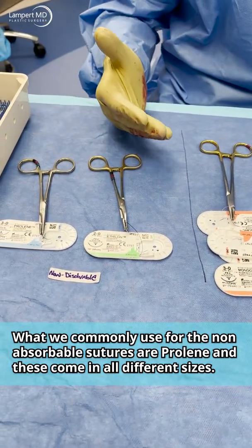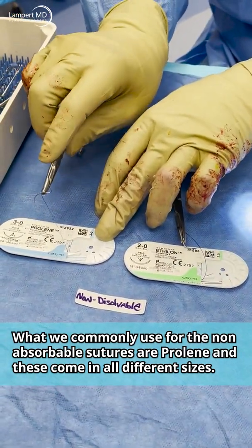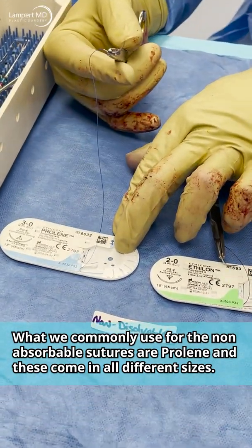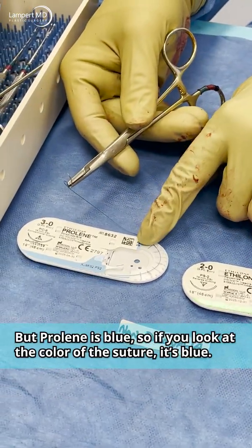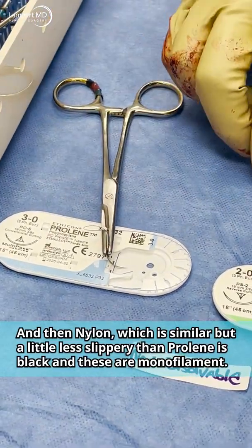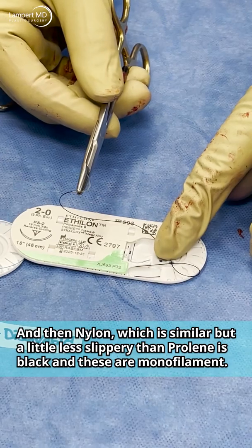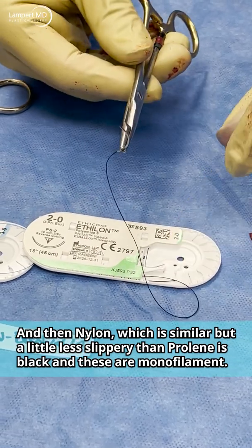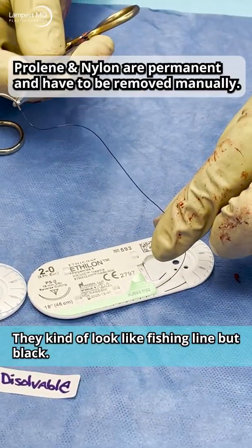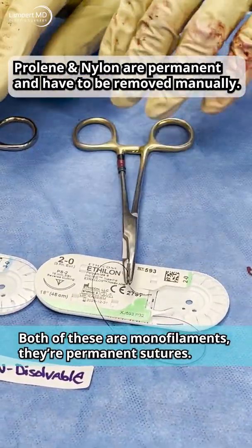For non-absorbable sutures, I don't like to leave them deep if we can avoid it. Common ones we use are Prolene, which is blue — you can tell by the color of the suture. Nylon is similar but a little less slippery than Prolene, and it's black. Both are monofilaments — they kind of look like fishing line. These are permanent sutures.